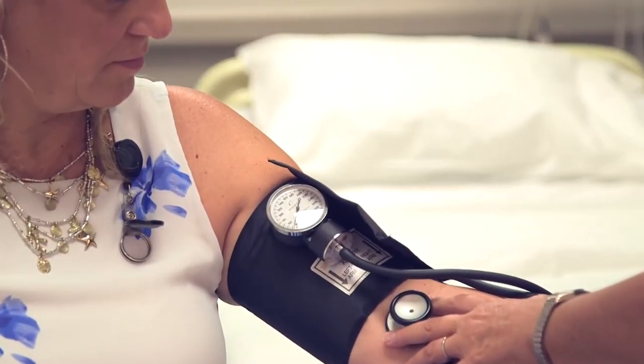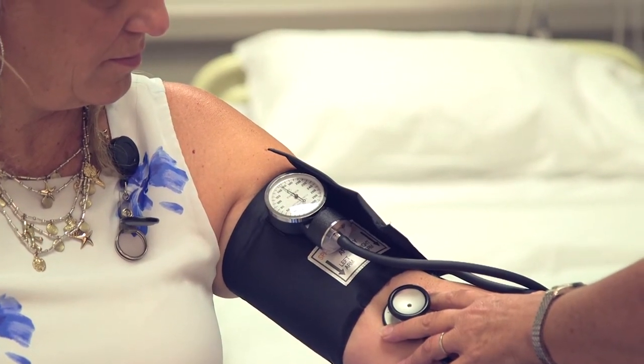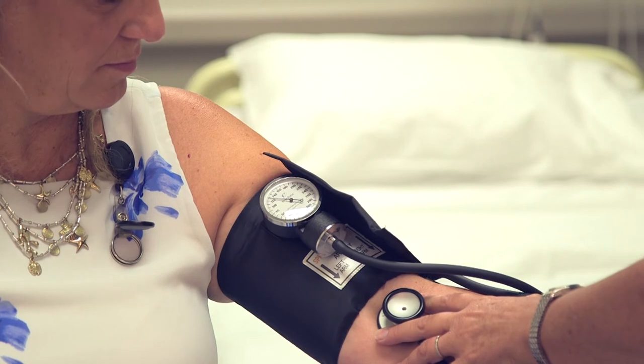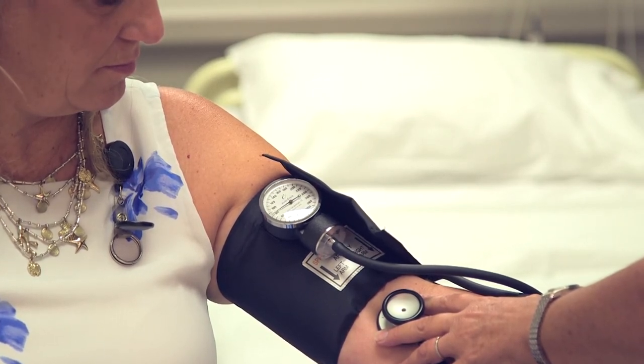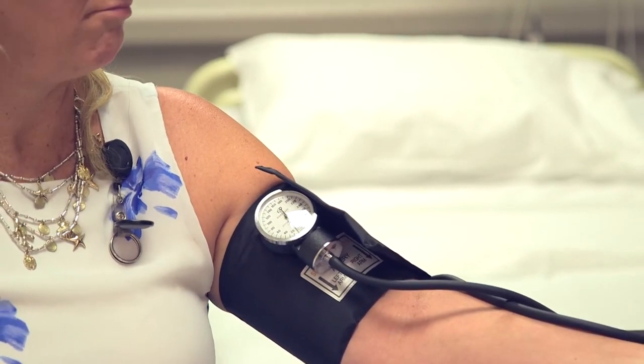So I'm going to go ahead and pump up her blood pressure to 150. And I'm going to release two to three millimeters of mercury per second. 142 over 82 is your blood pressure.